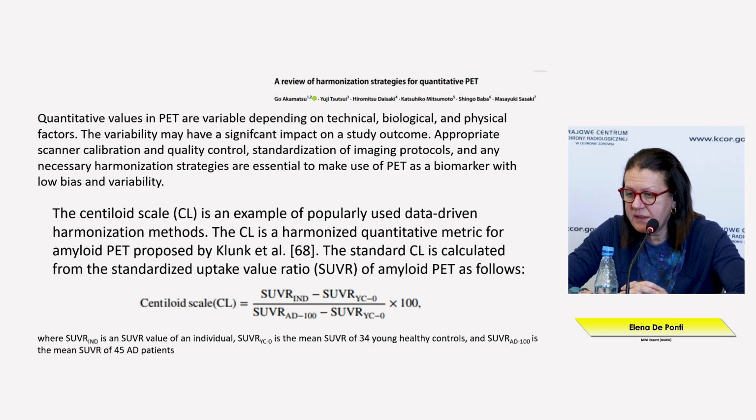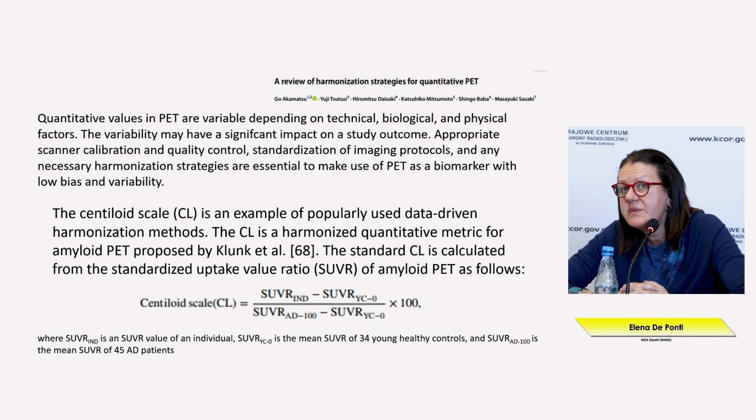In some particular applications, like in the brain, other quantification methods have been suggested and described.